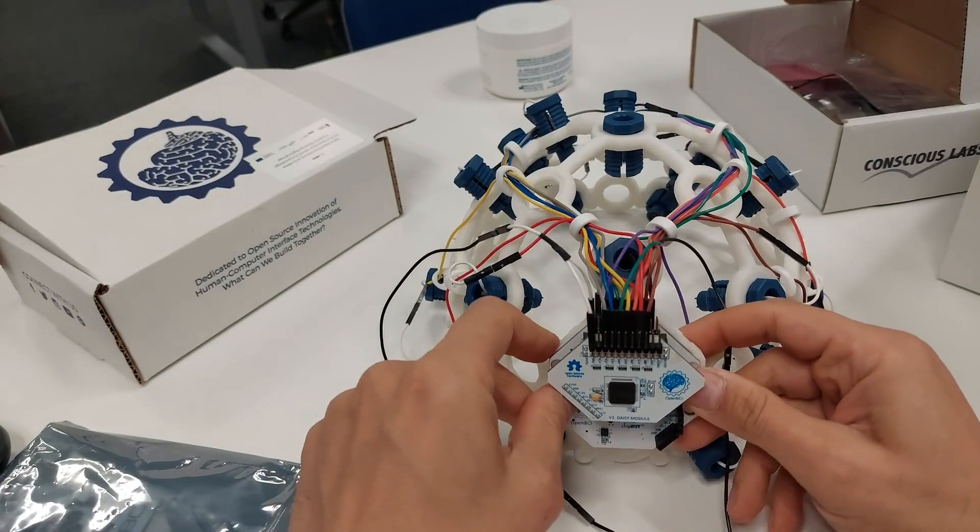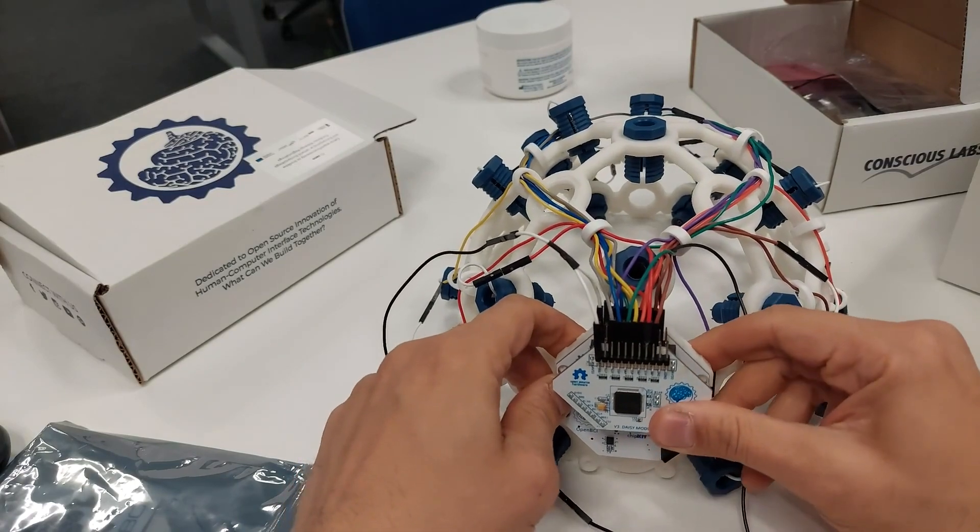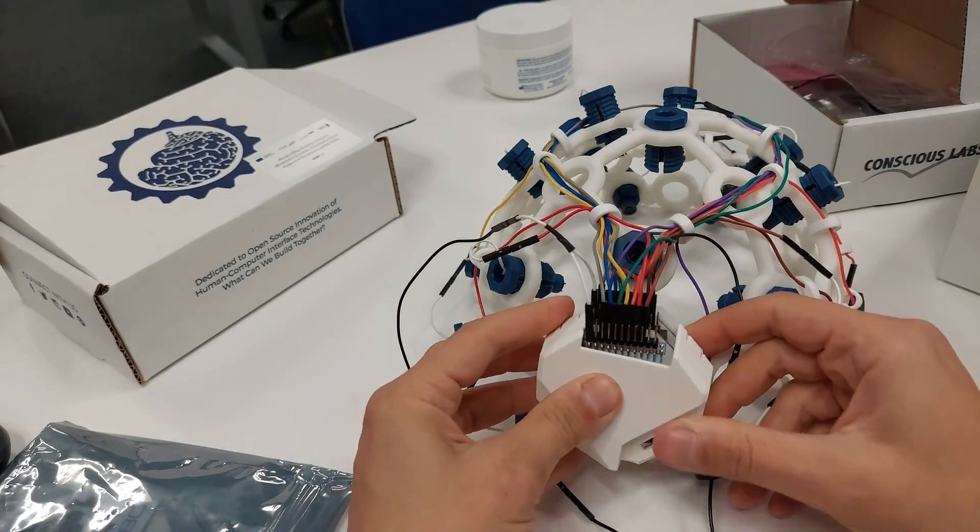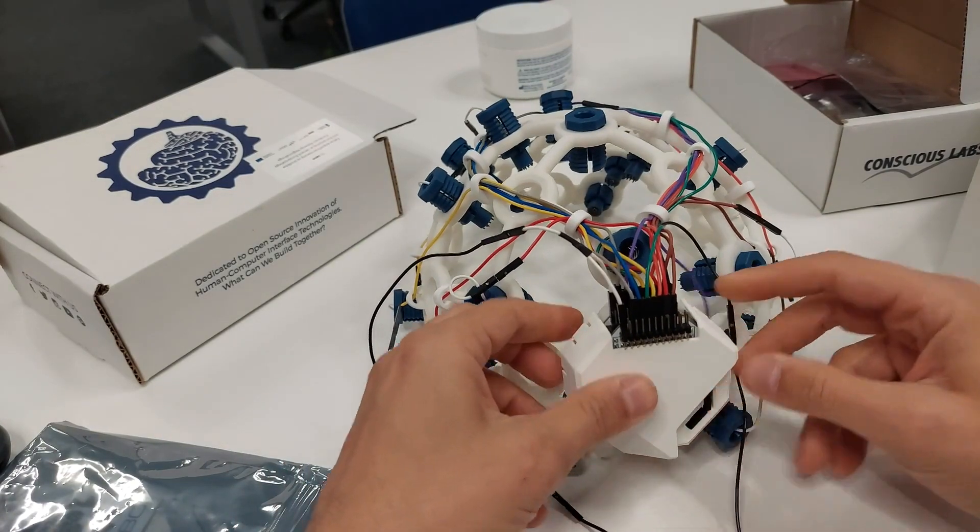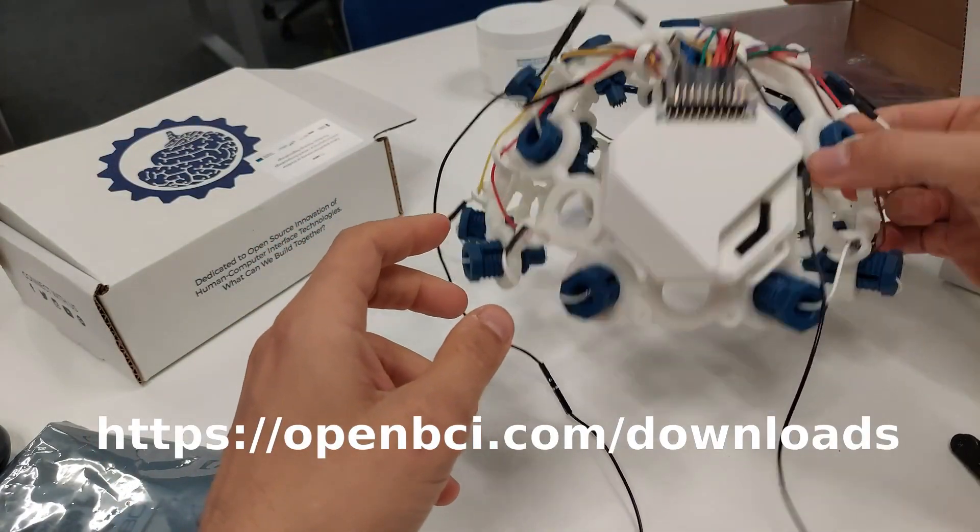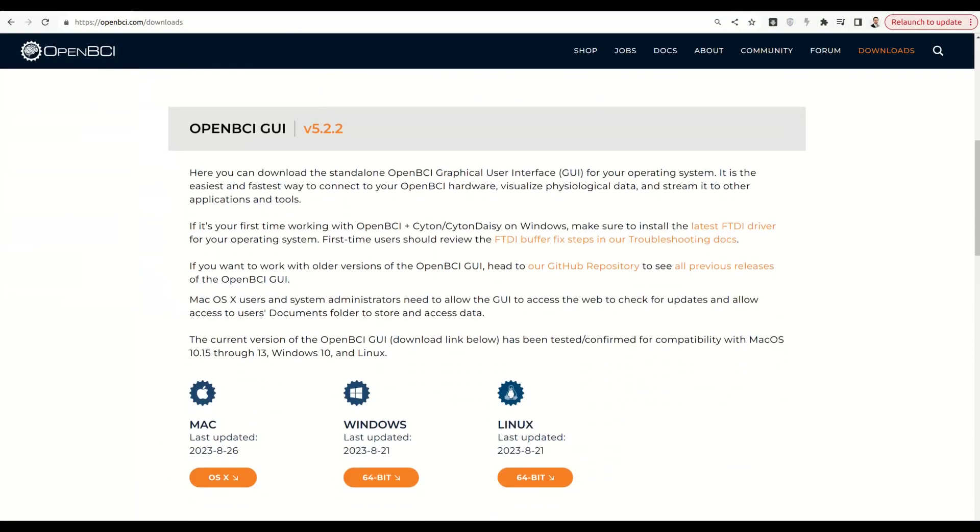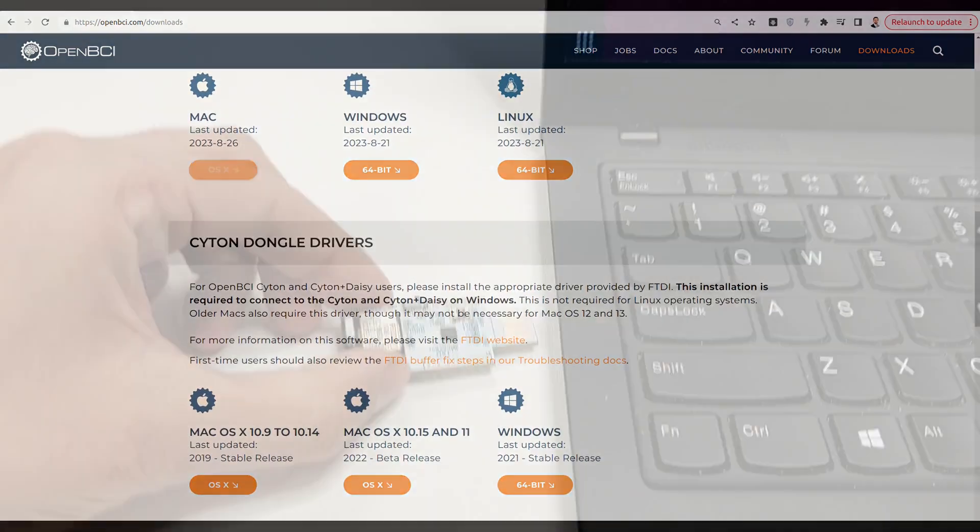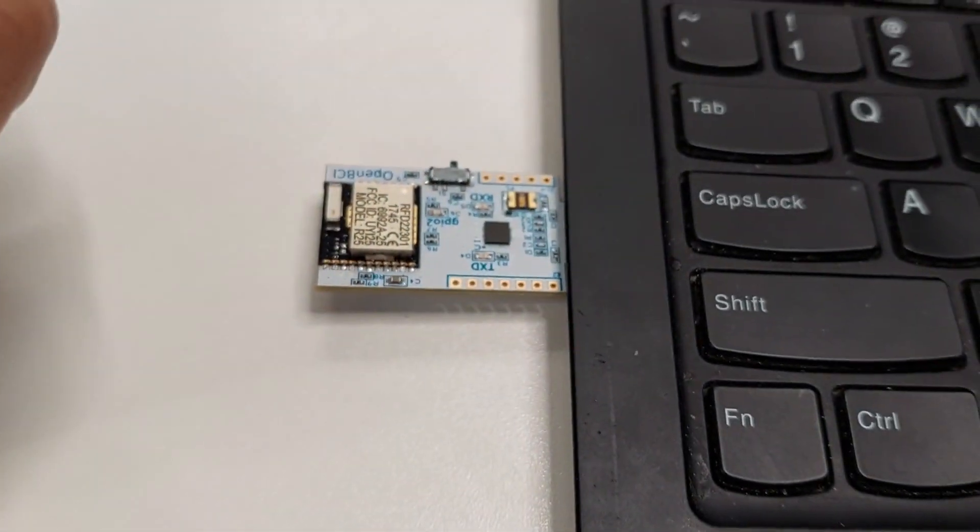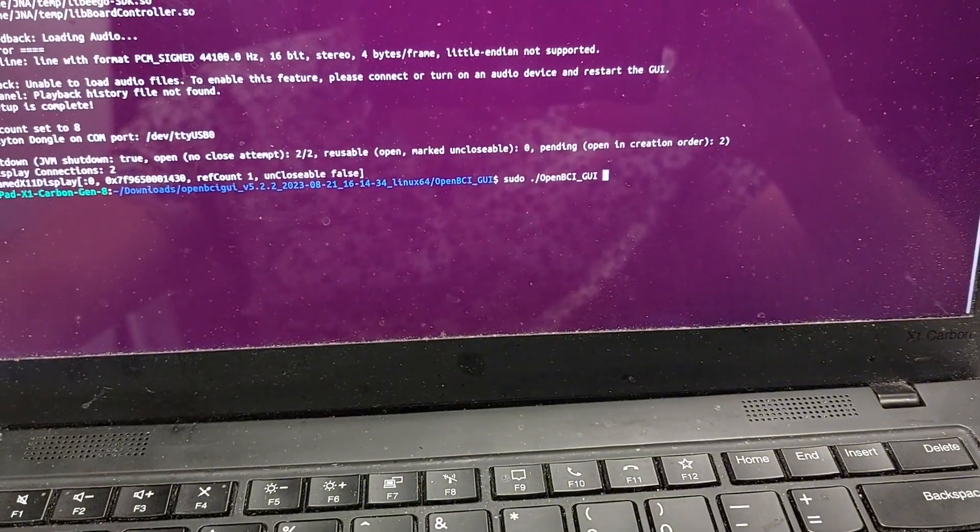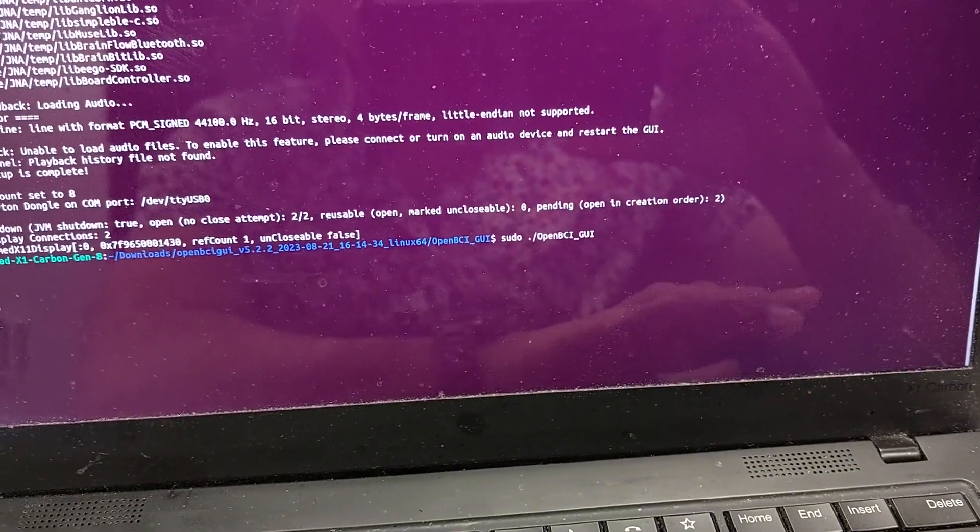The next step is to download the OpenBCI GUI for your operative system to see the time series directly on your computer and if necessary also to download the drivers. At this point you can plug in the USB dongle and you can launch the GUI. But if you're using Linux, either you give the rights to your user to access the USB input or you launch the GUI as a super user.